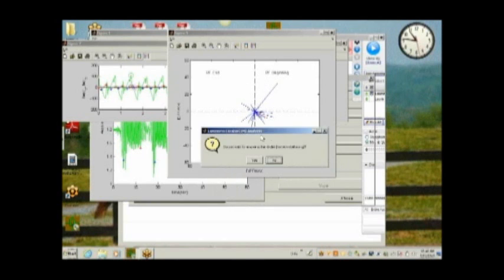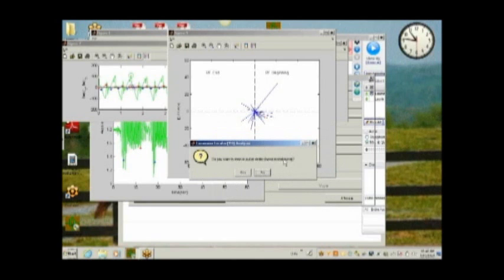However, for the purpose of running the analysis, the user is prompted to answer one additional question: Do you want to remove outlier strides for the horse misbehaving? An outlier is a ray or rays that are longer and in the opposite direction of the majority of other rays. Horses tossing their head will create outliers, which increases the variability of your data. These can be removed by selecting yes.